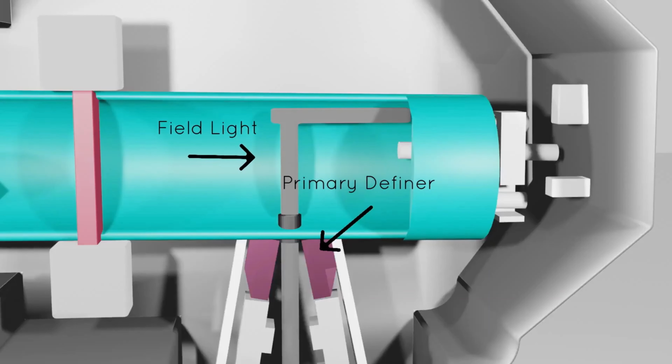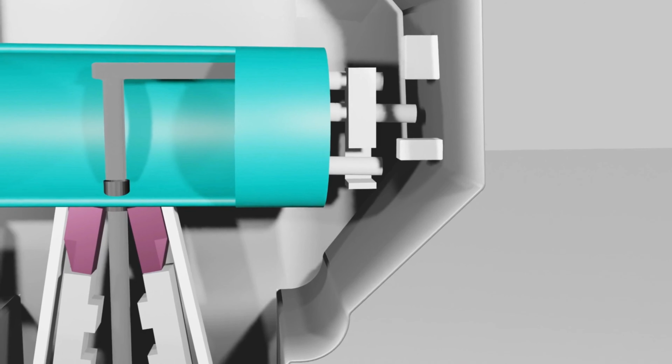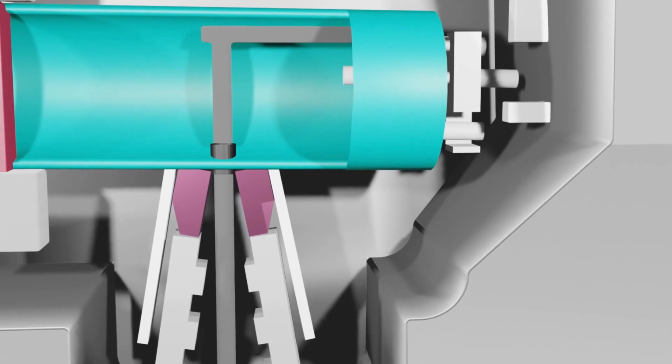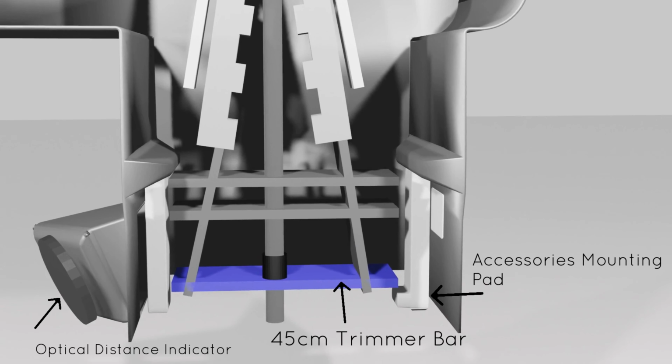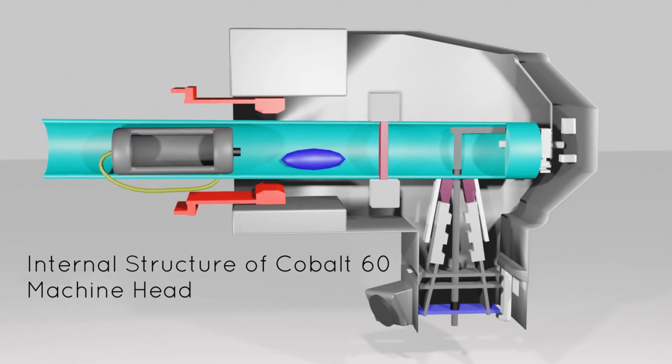Animation shows a two-dimensional plane of the described model as given by MCNP4B in an irradiation position, where the source appears inside the tungsten shield surrounded by a thick shield of lead. The scenario of the accident was drawn up according to an experimental study which illustrated an experimental model of radiation dose measurements for occupational personnel during a source stuck. A PDM, portable dosimeter, and Kodak radiation monitoring films were fixed on a Rando phantom.